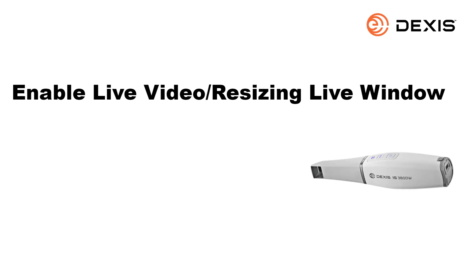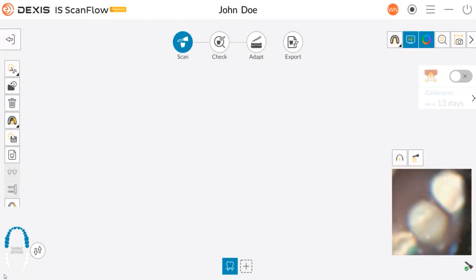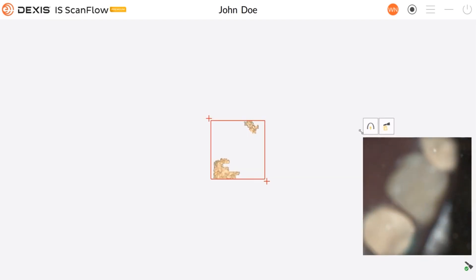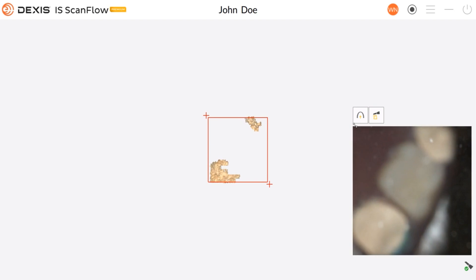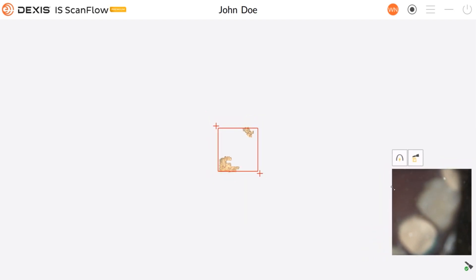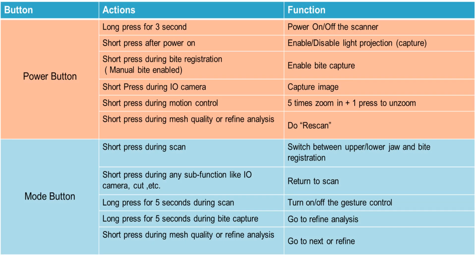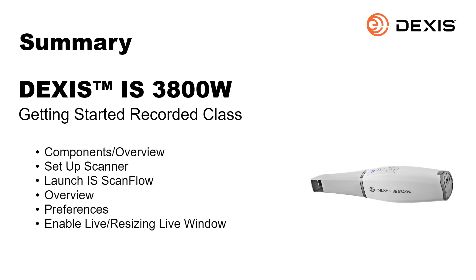To activate the live video, pick up the scanner and press the power button for one second. If you would like to expand or shrink the live video window, grab the top left corner of the window and drag it out to expand or drag it in to shrink it. Listed are the actions and functions of the power and mode buttons in the button functionality quick reference guide. This concludes the DEXUS IS3800W Getting Started Recorded Class.